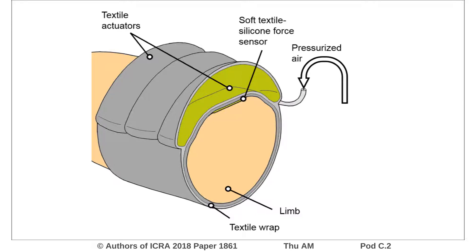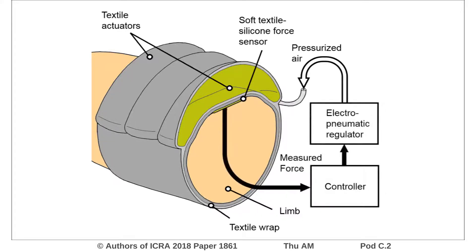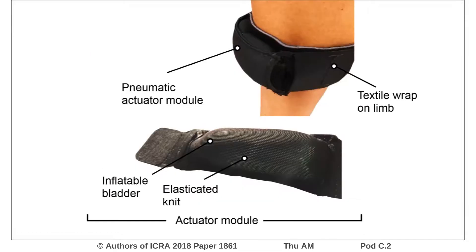This force signal is then fed into a control system that regulates the air pressure within the actuator to generate the required force according to a reference force input. The devices are fabricated from textiles. The actuators use a thermoplastic bladder and a combination of extensible and inextensible materials in order to direct force towards the muscle.